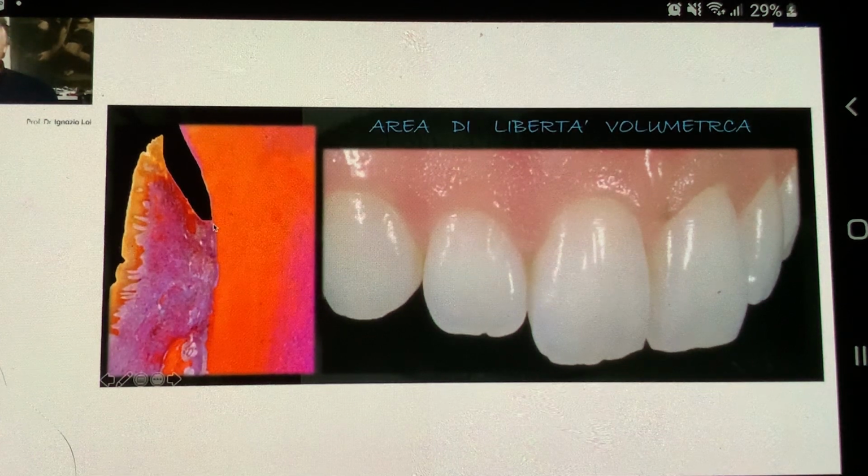And then there is also another part which is not touchable. So this part is touchable and it can be considered as an area of freedom where, as we saw before, when we saw those two cases before, with those volumes and with the finished lines, I can interact with this free part, so the part of the tissue, modifying and manipulating the shapes.